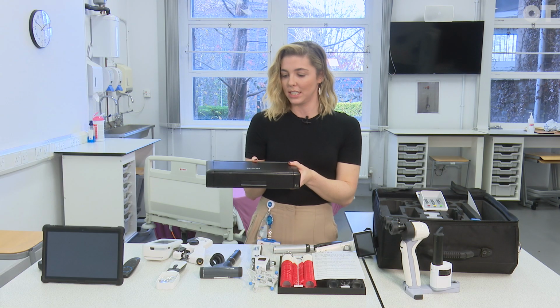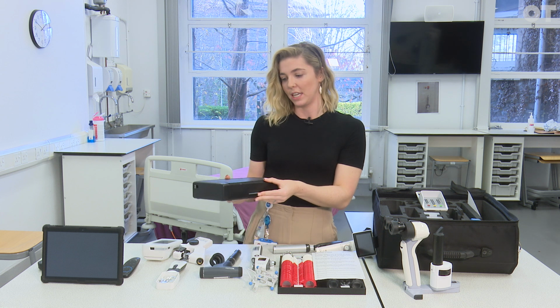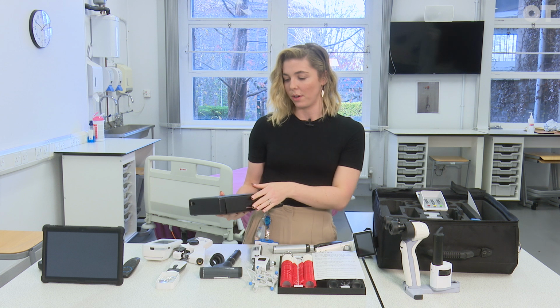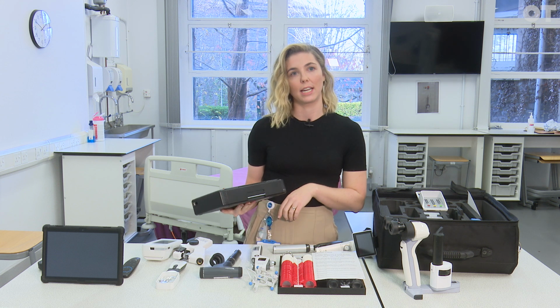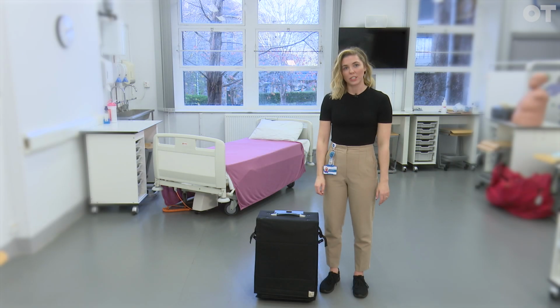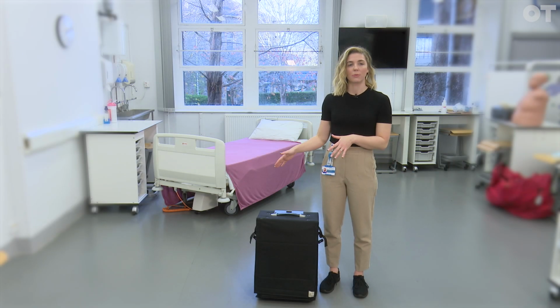So we have portable printers. These are, again, patients love these. They go wild when you bring them out. So these are really handy to bring around with you. It means that you're following all of your NHS guidelines and all of your legal requirements to print off any paperwork they might require. We dispense our patients at home as well, so we needed a nice way of carrying frames to them.